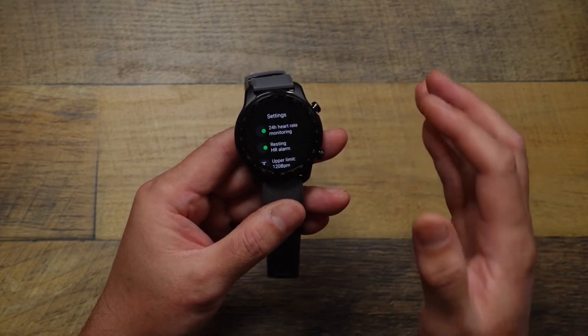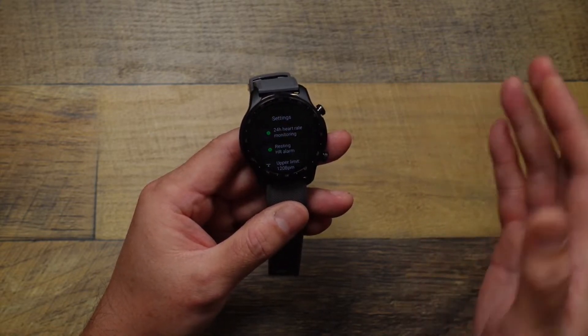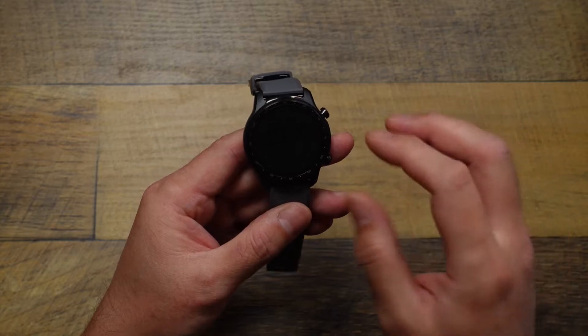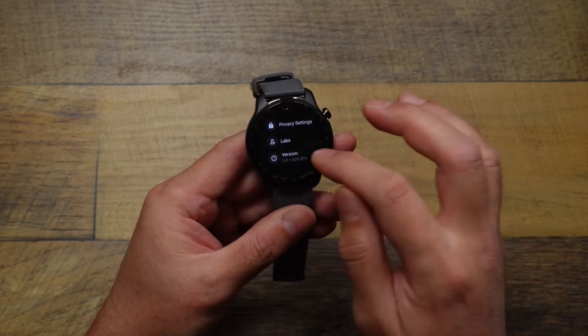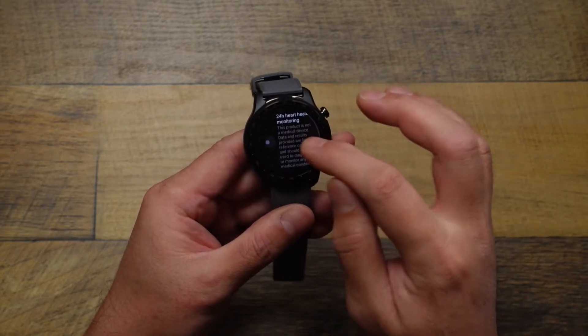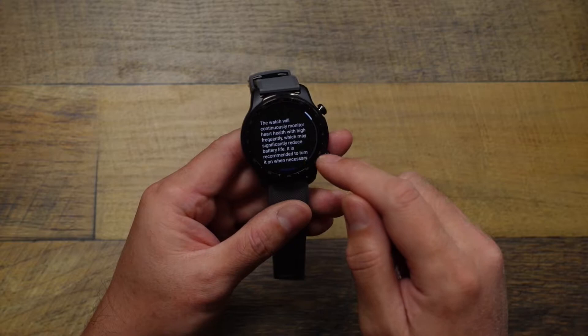That's different from 24-hour heart health monitoring, which is gonna enable those two features — irregular heartbeat detection and AFib detection. So go into here, scroll down into Labs, tap that, and here's where you have that 24-hour heart health monitoring. Tap to turn that on.